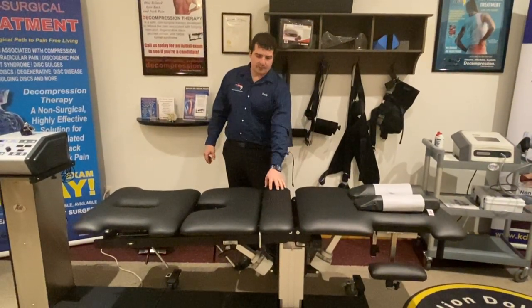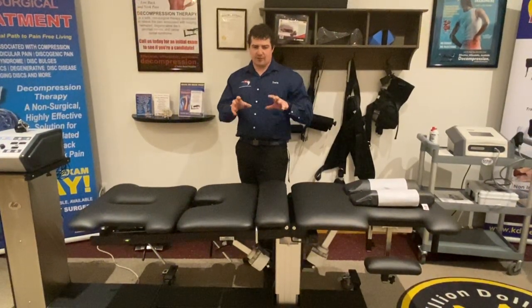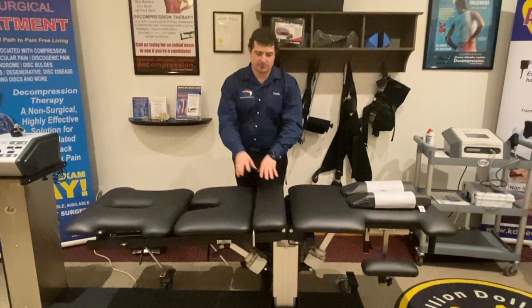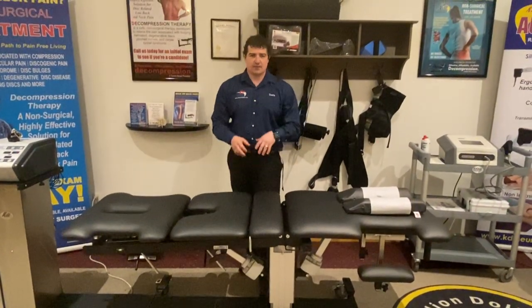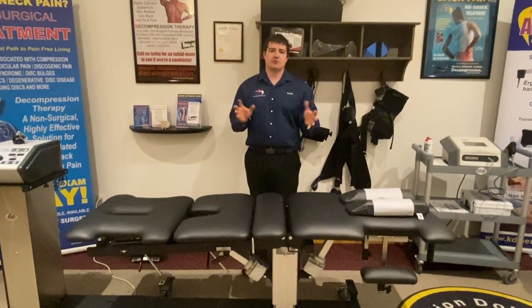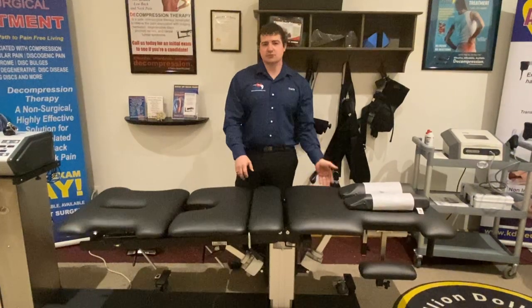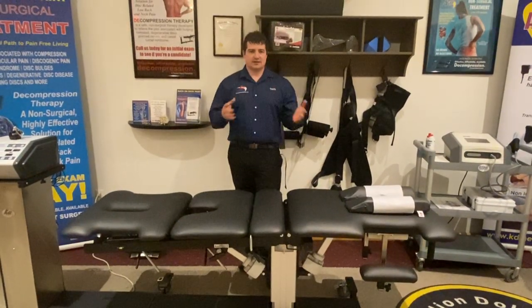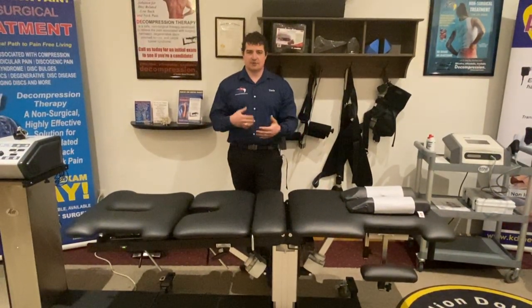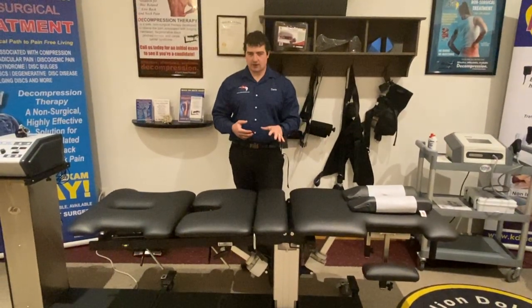We added a pelvic drop to the section to allow a doctor to adjust ASIS pelvic issues before or after the decompression visit — quick, easy, and smooth without moving patients from room to room or table to table. Up here we have a vibration control. You flip it on and it does 60 hertz of vibration, which can relax back muscles. It's very well researched, so that's another option.